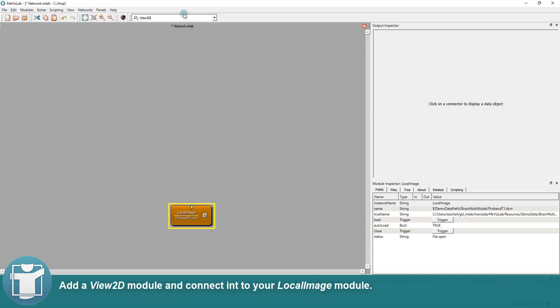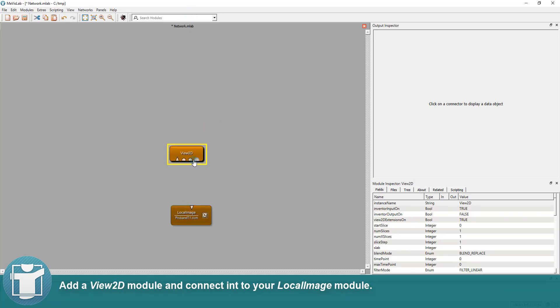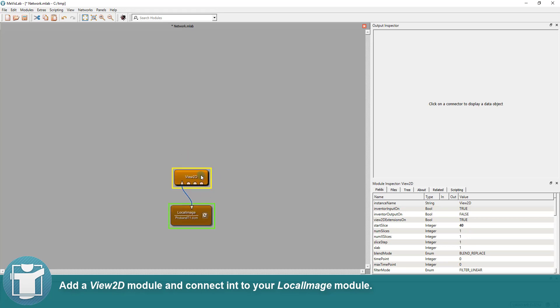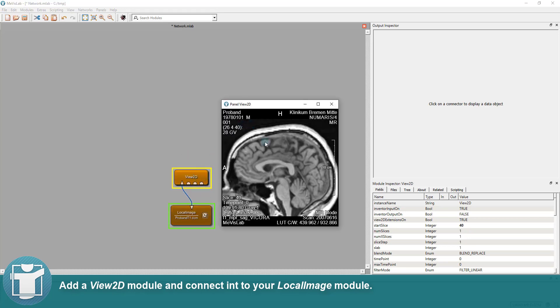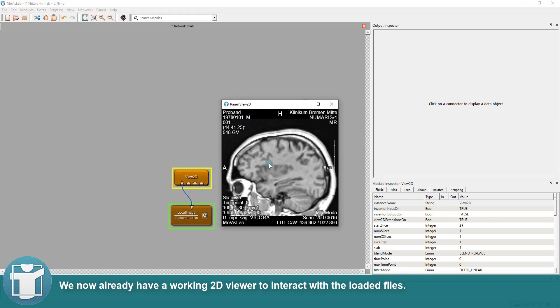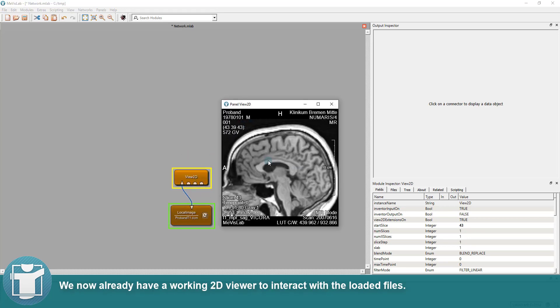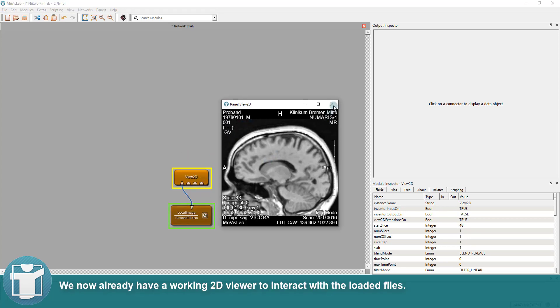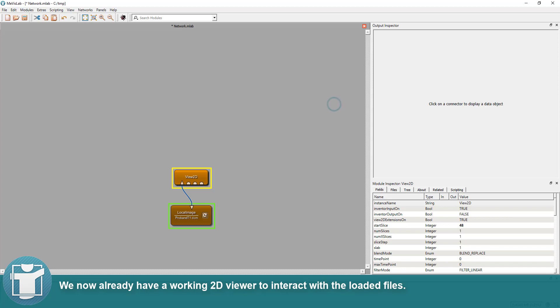Add a View2D module and connect it to your local image module. We now already have a working 2D viewer to interact with the loaded files.